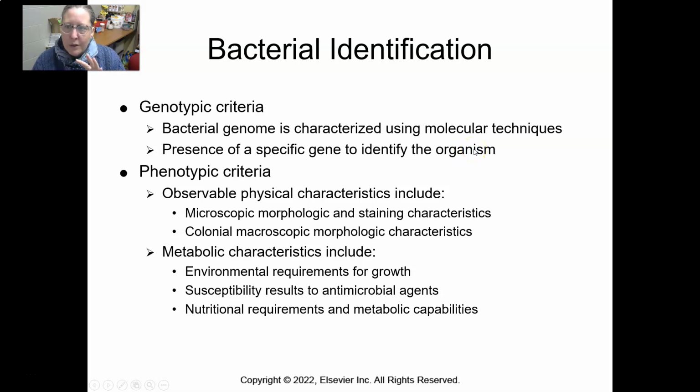Certain genera have specific genes present, and then the other genes vary by species, and so that's how you can get a definite ID. Those methods test for those genes that are unique, right? Not the ones that are in common to all bacteria, for example.